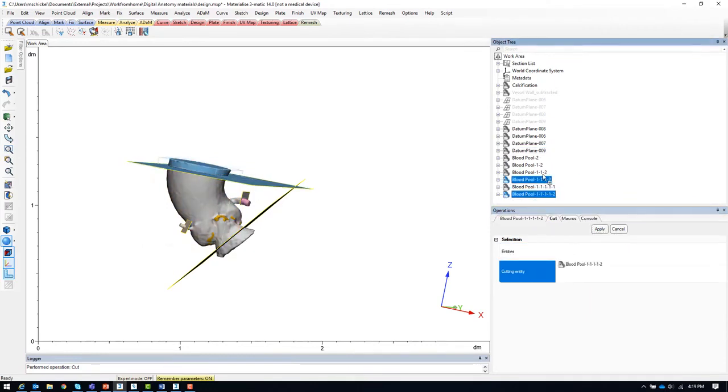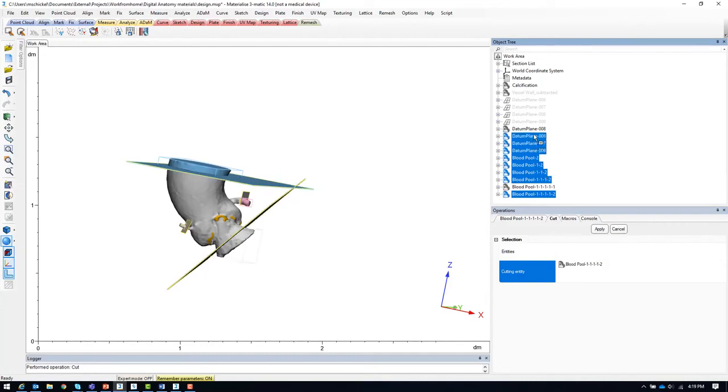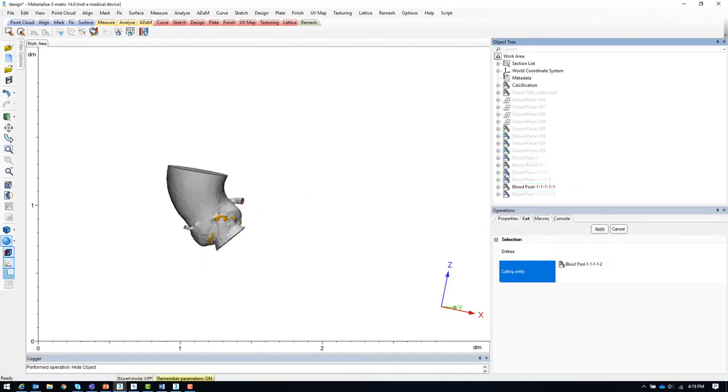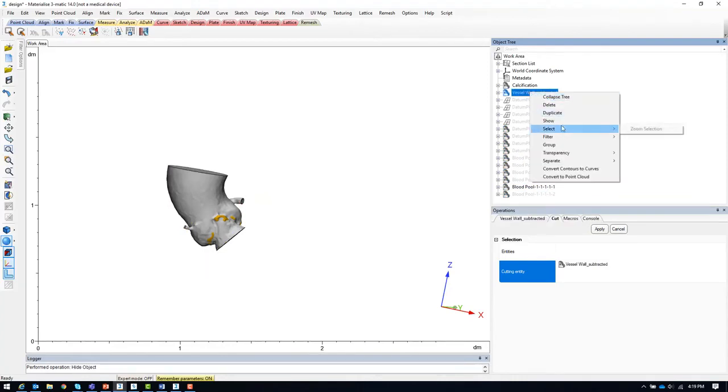We should now have our final model of the internal cavity with the one millimeter insets from the vessel wall model.